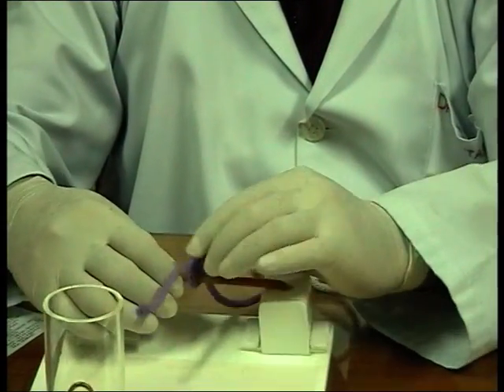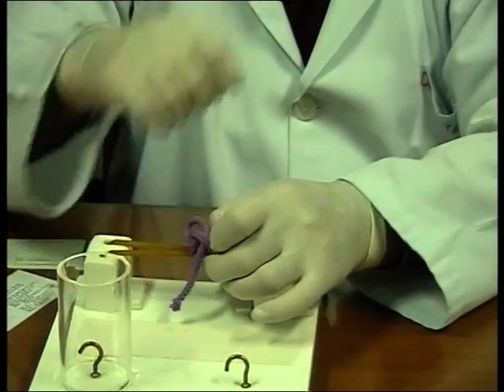You must remember to cross. If you don't cross, it will be a granny knot as we see. So the surgeon's knot is clear?